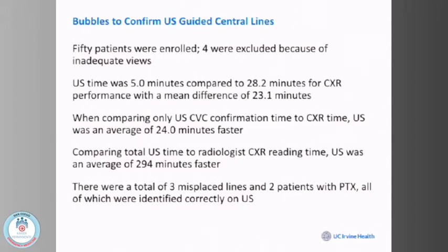So, did you have a question? No, I mean, at your institution, are you still getting chest x-rays? Because a lot of these things that you're talking about, we know it, but when we call our consultants, they go, yeah, what did the chest x-ray show? What did the official echo show? We get chest x-rays done on 100% of our patients.